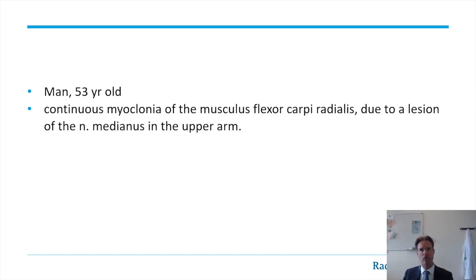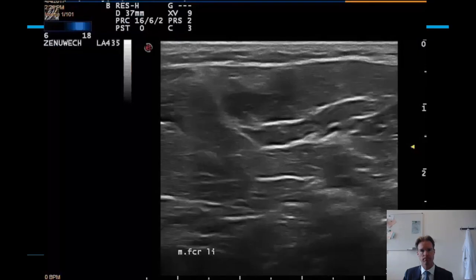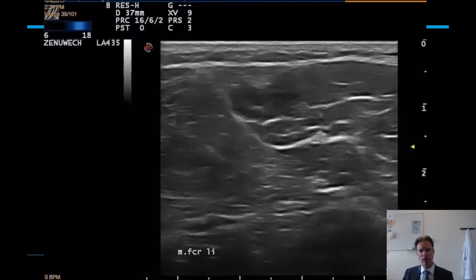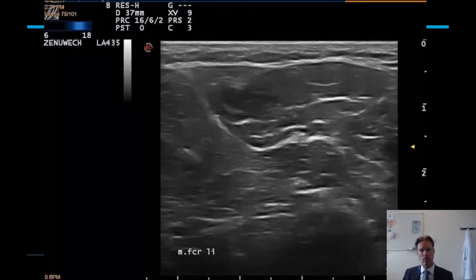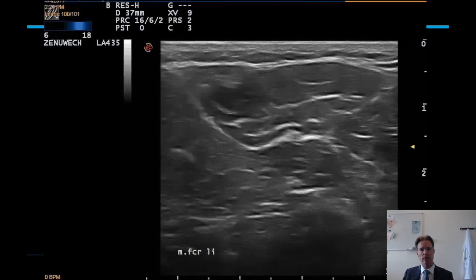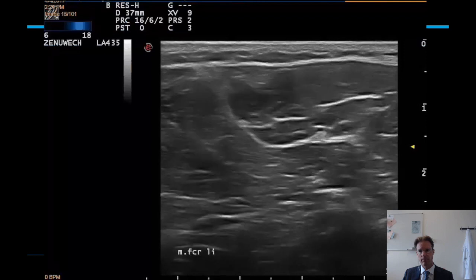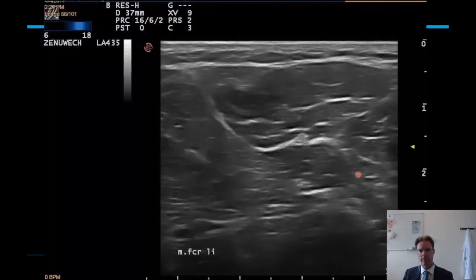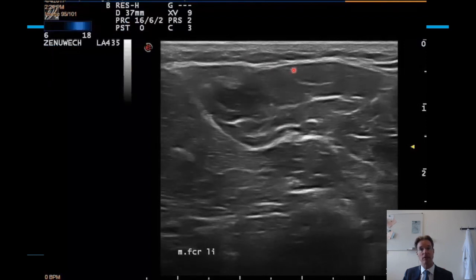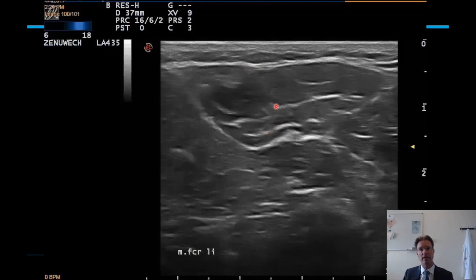On the next slide I will demonstrate a movie showing this activity. The activity mainly occurs in the flexor carpi radialis. Injection of this muscle is pretty easy, especially with the help of ultrasound.